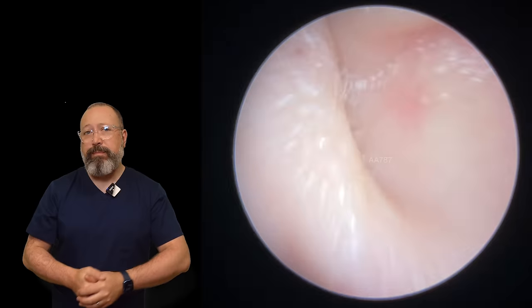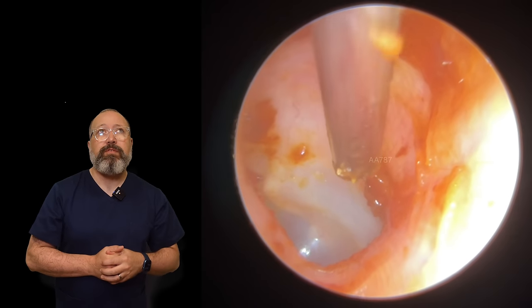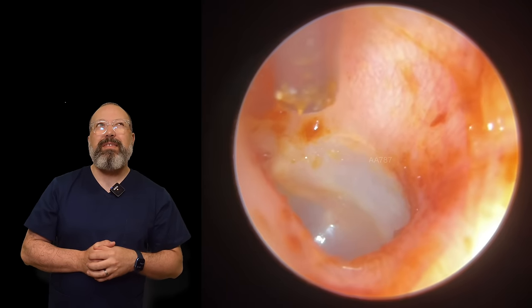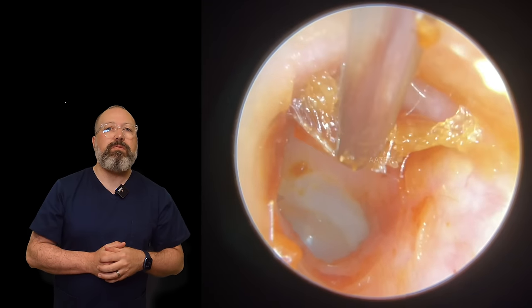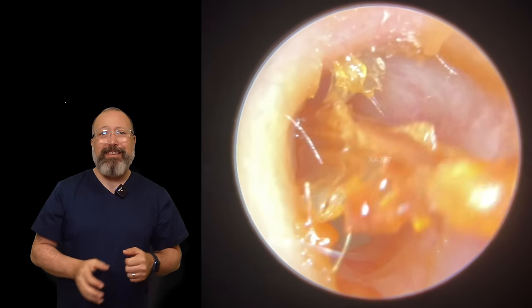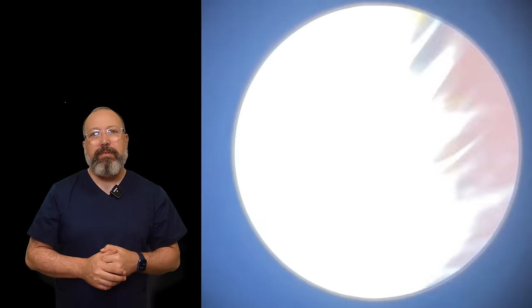If you don't mind liking, sharing, subscribing, and following that would be absolutely fantastic. We're just getting rid of a little bit more — you'll see the lovely Mr. Taylor Green here too, I think we're due to voice-over some videos at the end of the week. Look at the skin that's peeling down there — that is a huge piece of skin coming away really well.